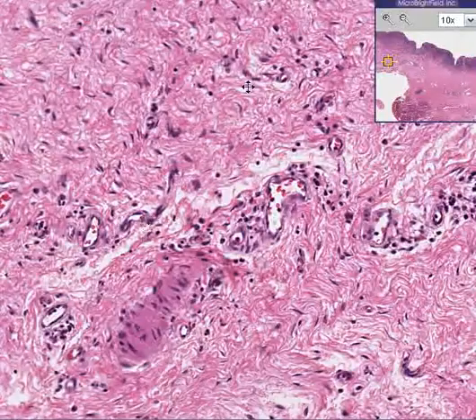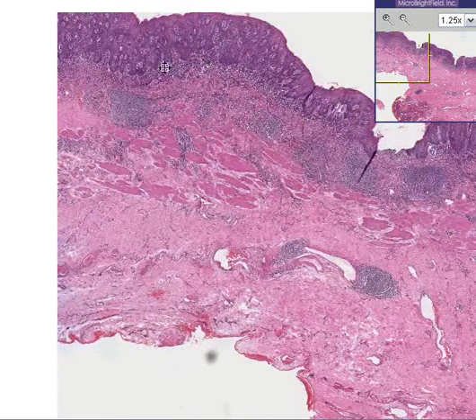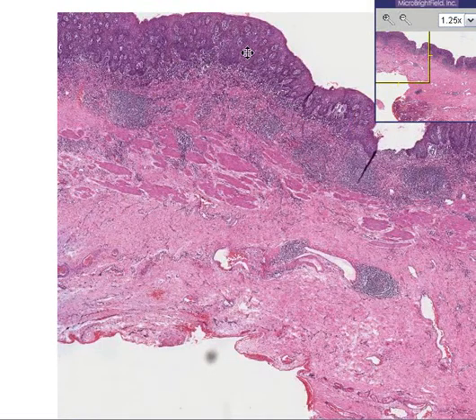And I think you could safely say that the majority of this inflammatory process is limited to the two superficial layers of the classical GI tube, the mucosa and the submucosa, and the muscular wall and connective tissue of the adventitia are relatively spared. This is chronic esophagitis.